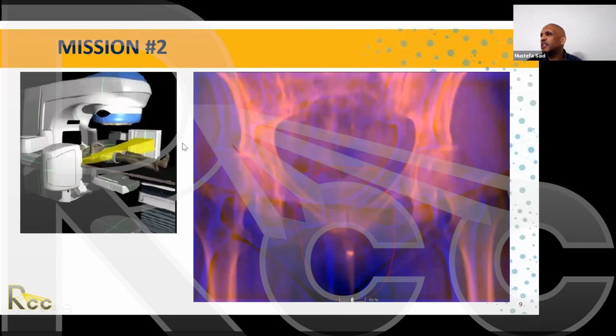Here's the positioning and imaging. You can see here the orange is the DRR and your daily setup right here, and you have the PTV right there. It shows you how far off the patient is. That's probably close. Look at that right here. So, you have good things. We have IGRT to image and stuff like that.